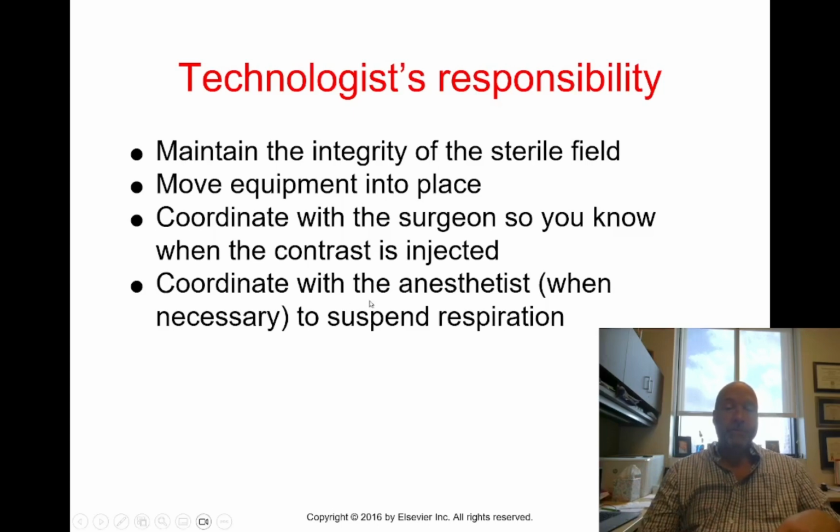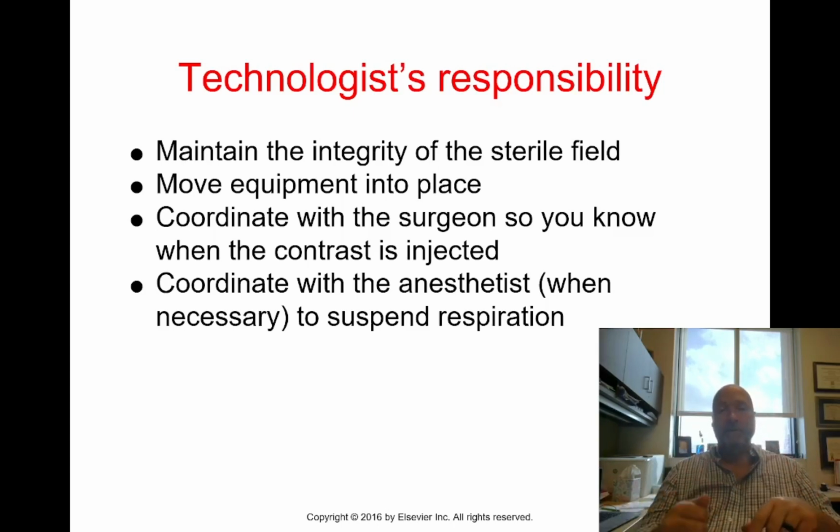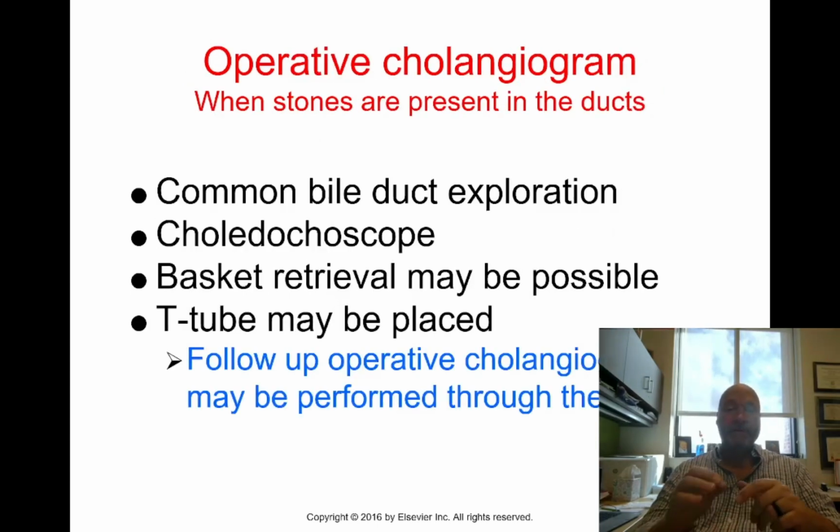If you're using portables, then most of the time you're going to take two images. So you put the image receptor in there; there should be a little canal in between the base of the bed and the pad the patient lays on. You put it in, you make your exposure, you pull it, well, in a digital world you wouldn't pull it out, you'd shoot it again just to make sure that any dark spots don't move. If they do move, that's an indication, again, that it's an air bubble. If they don't move, then that's an indication the patient has a gallstone somewhere inside that duct.